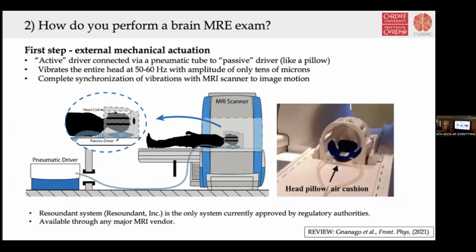In the setup, acoustic energy generated by the pneumatic driver is transferred through the tube, and it vibrates the back of the head through that soft pillow, which is known as the passive driver. It's very easy to use, very robust, which is great when working with clinical populations. So I think the availability of something like this helps with the standardization of brain MRE and helps advance brain MRE through its availability.